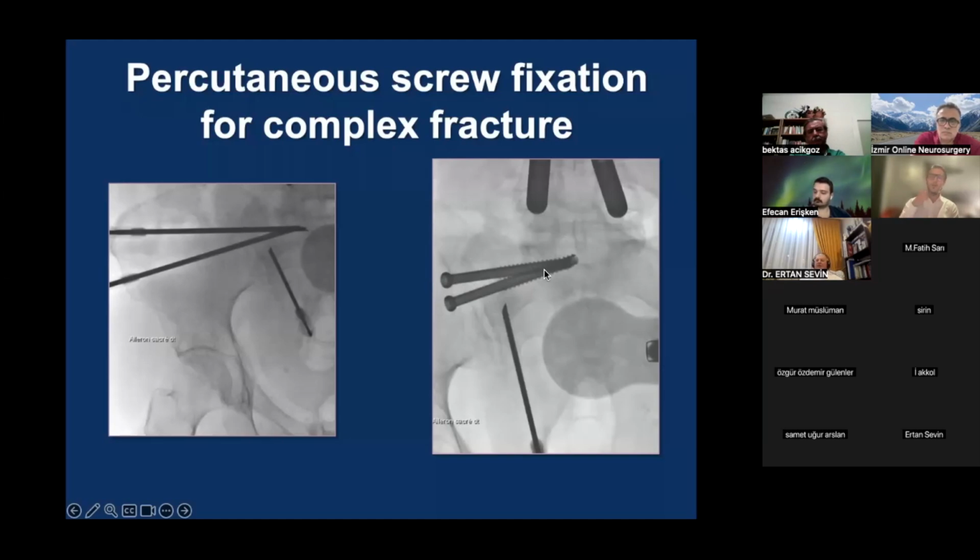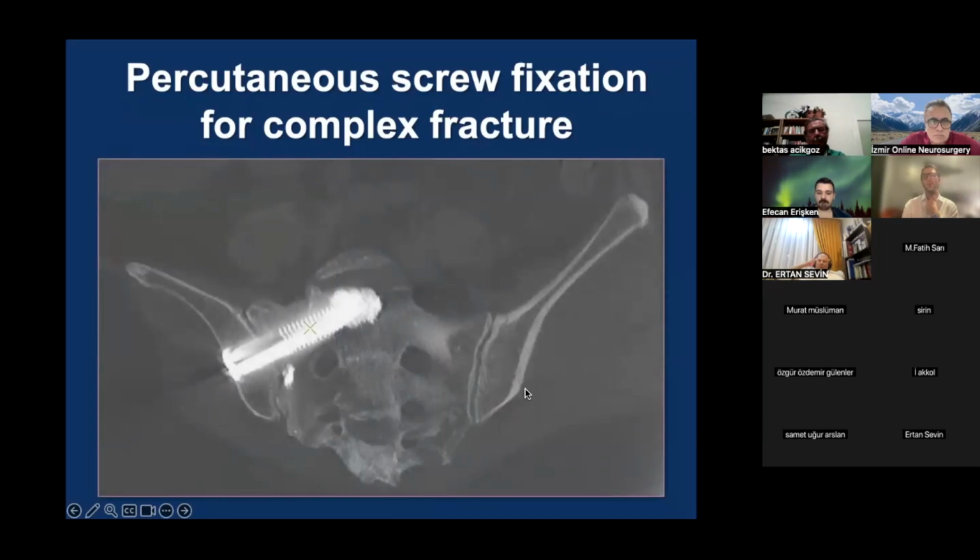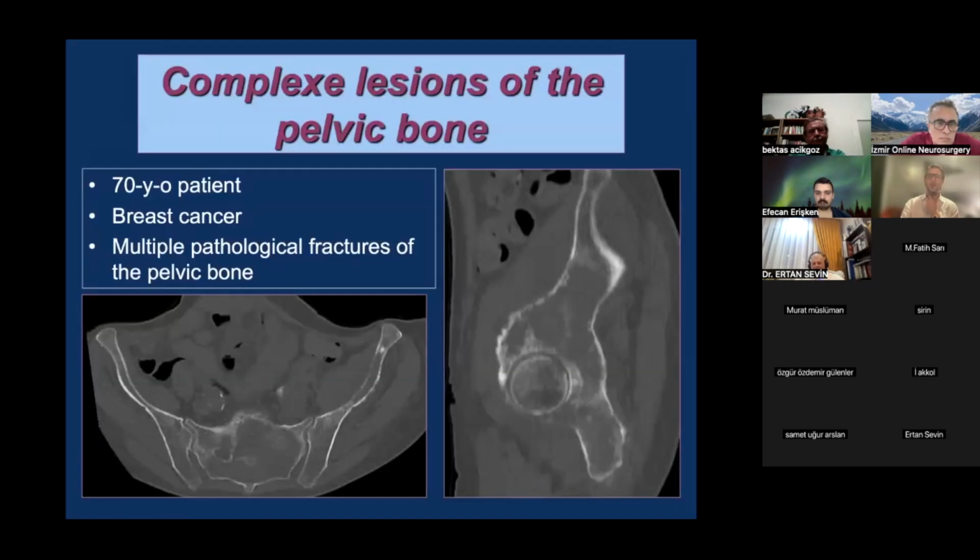And afterwards, as for the cervical screw fixation that I showed you, we position this screw through the transsacroiliac approach to obtain a consolidation of the fracture. And here you have another bone needle to inject some cement and to consolidate this screw fixation. So you can see here the two screws with the transsacroiliac routes. We use the electromagnetic guidance tool that I showed you, the IMACTIS electromagnetic guidance, to have a very accurate positioning of the screw, and it helped to treat this fracture very easily.